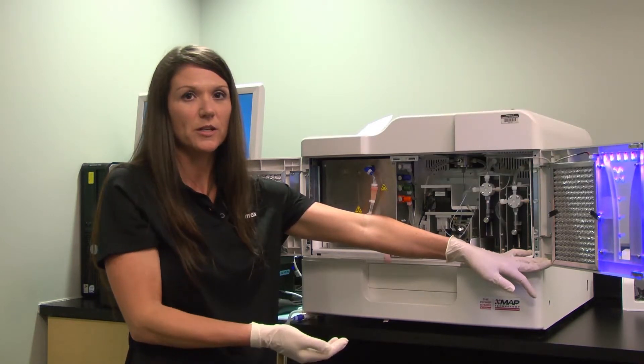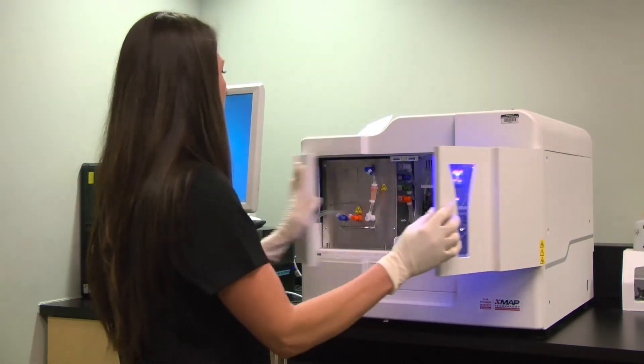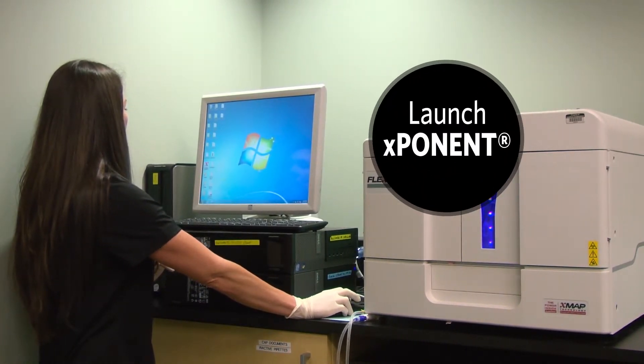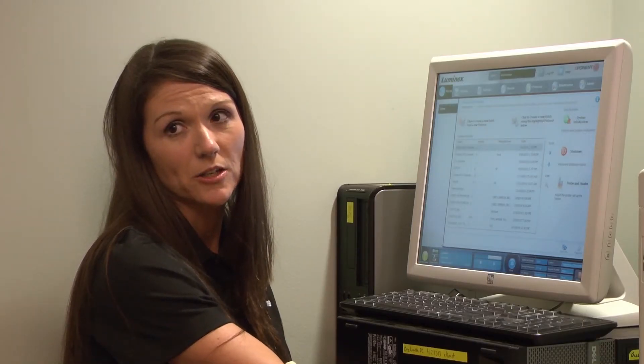Once the instrument has started up, now we want to log into our Luminex Exponent software to make sure that the instrument is going to connect. So go to your computer and launch Luminex Exponent software. Once you've logged into your software, you can see here that the instrument is connected, and this is the last indicator that the instrument was successfully started up.